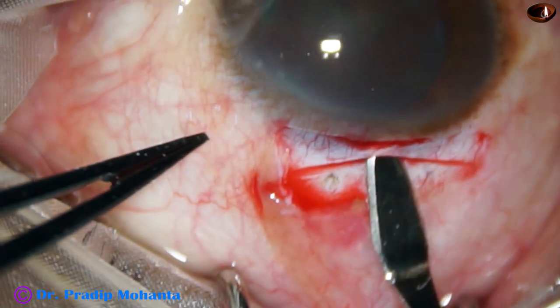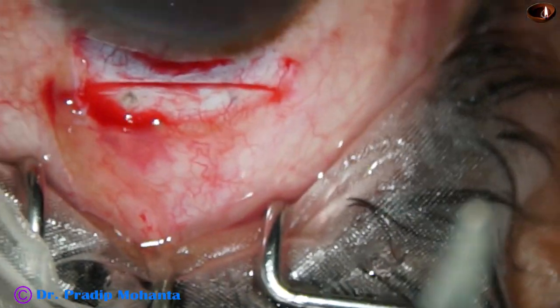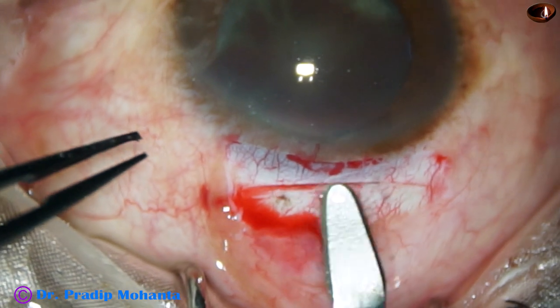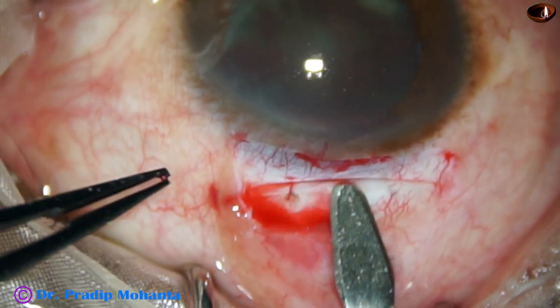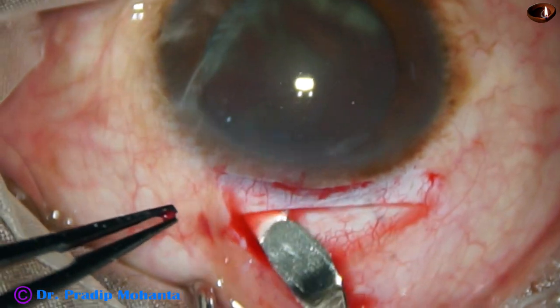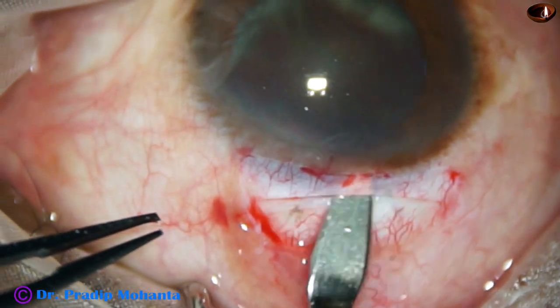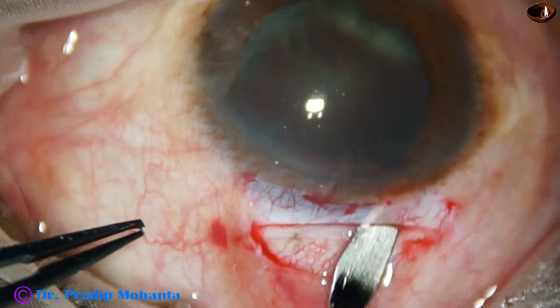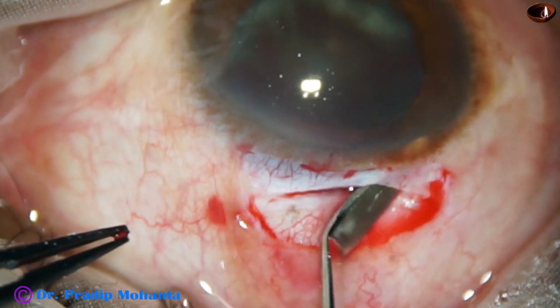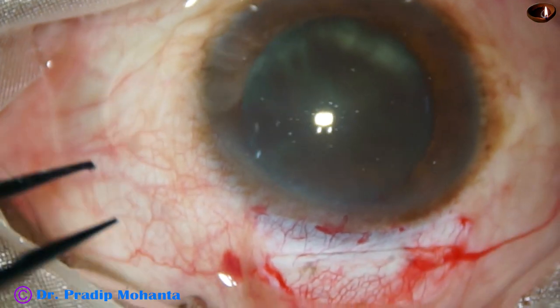This is how you make the tunnel. The crescent blade goes into the clear cornea for about 2 mm. The chin of the patient was elevated too much, and the head position has been corrected. Now the sclerocorneal tunnel is being done. The superior rectus bridal suture is keeping the eyeball stable, and we don't have to use the left hand most of the time for making the tunnel. If we want to use the left hand, we hold the limbus. The tunnel is now made — it is a blind tunnel at this moment; the corneal side is not yet open.